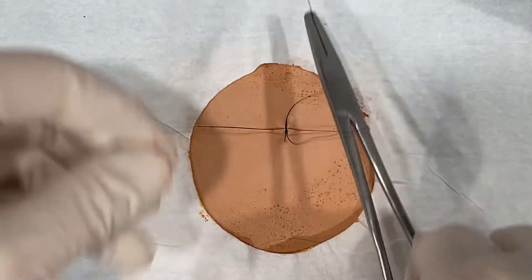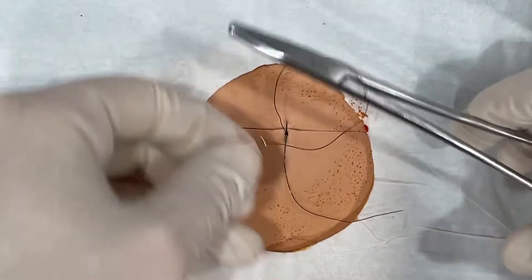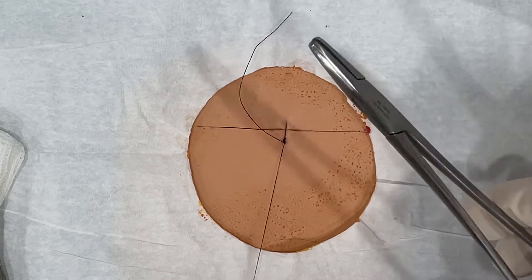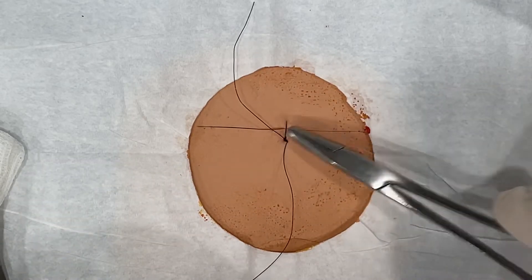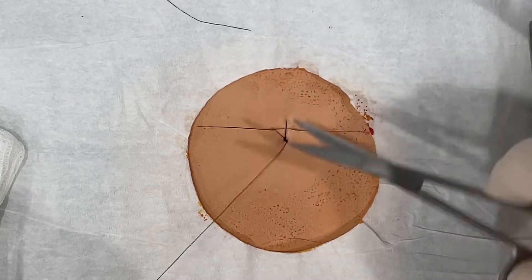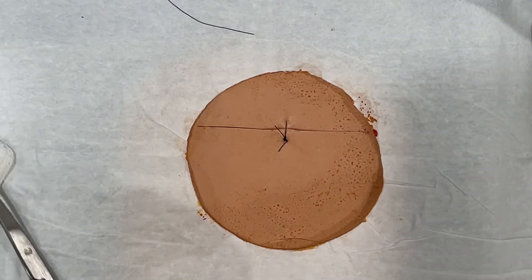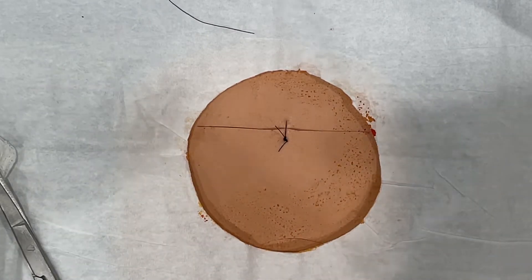Most people do five or six throws — we'll do one more just to make sure. I like 4-0 most places. When you finish, you see how it's not too tight? You can slide that knot — you want to keep the knot away from the center of your laceration. Pick a side and slide it over. Then cut your excess tail off. And that's your first suture — you repeat these until the laceration is appropriately sutured.